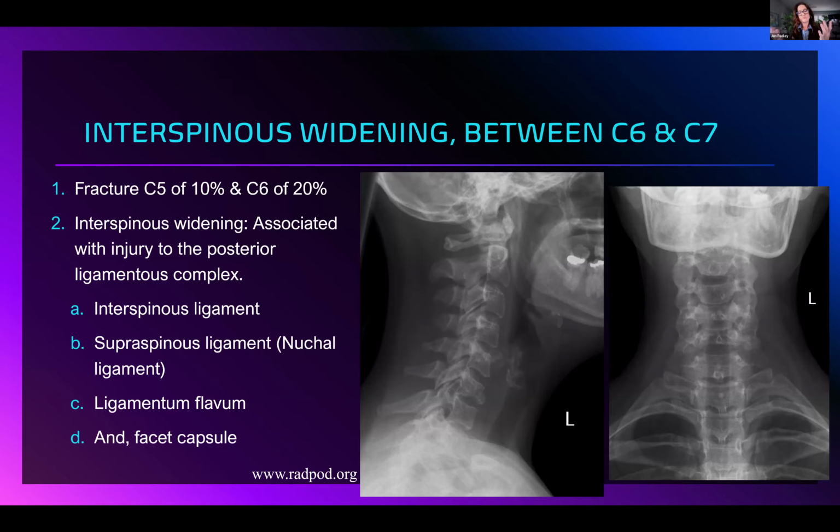But again, if that MD or other radiologists are not in the PI world, then they may not mention edema adjacent to facet joints. Which is very painful. Facet joint, very, very painful. Lots of symptoms.